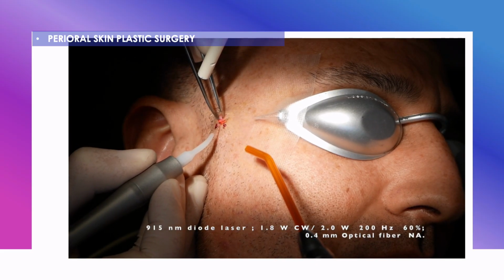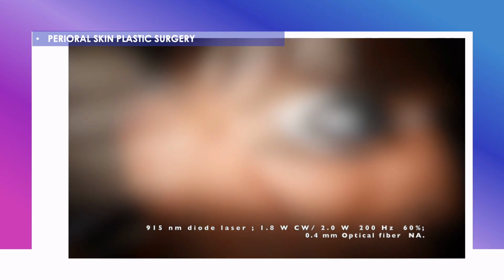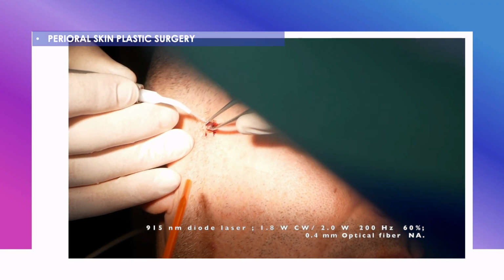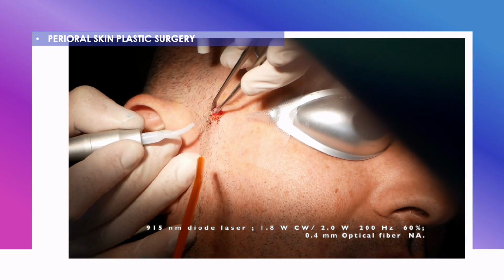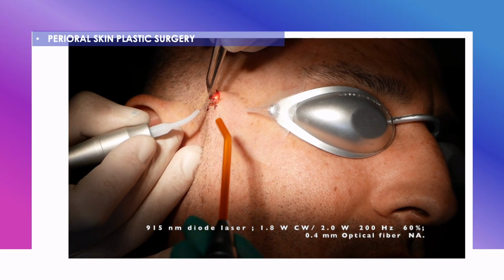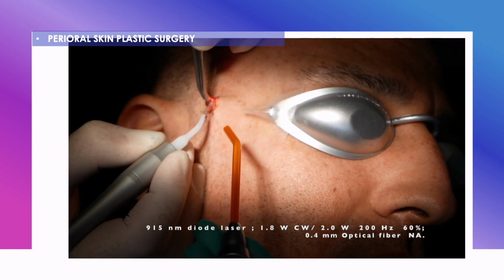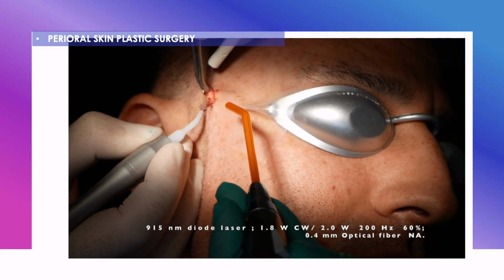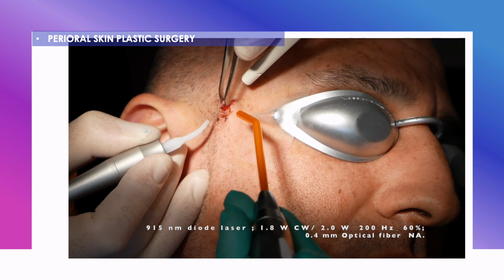It is absolutely important to provide to the pathologist for the histological examination a bioptic specimen larger than the implant base of the lesion. We must take 1 or 2 mm more to make a correct diagnostic process possible. As you can see, there is no bleeding or moderate bleeding during the procedure, and the surgical suction is only useful to remove undesired smoke from the surgical area.